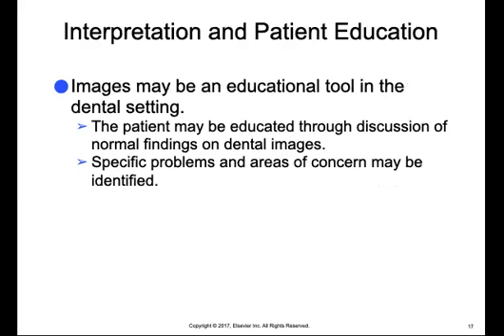Interpretation of dental images can be used as an educational tool in the professional setting. In addition to providing a preliminary interpretation, the dental radiographer can educate the patient by identifying and discussing what is normally found on a dental image. Then the dentist can focus on specific problems or areas of concern. Educating patients through the use of dental images can help everyone work together as a team.